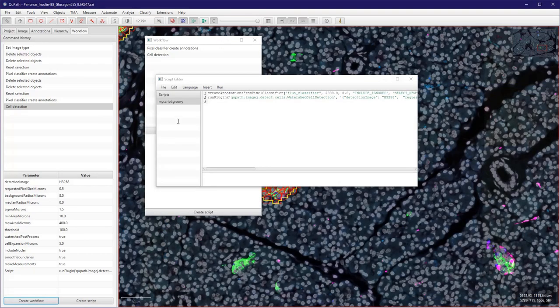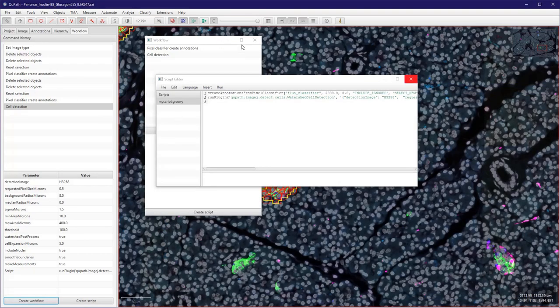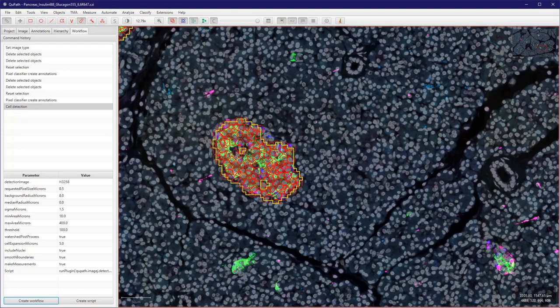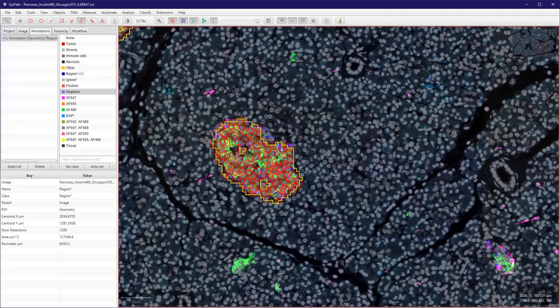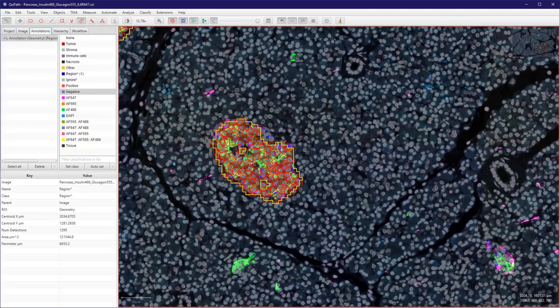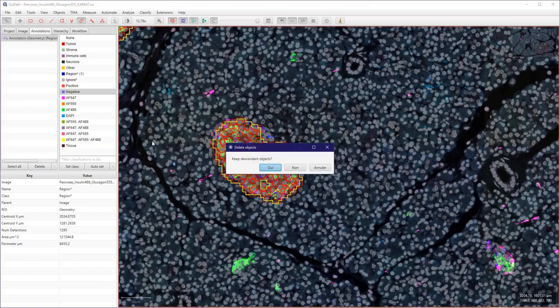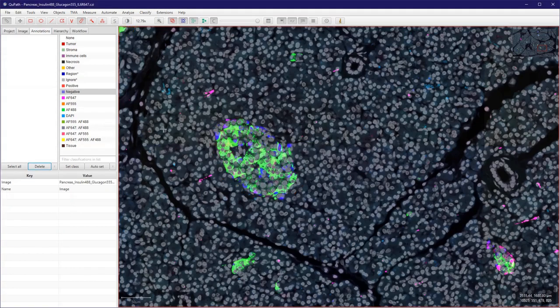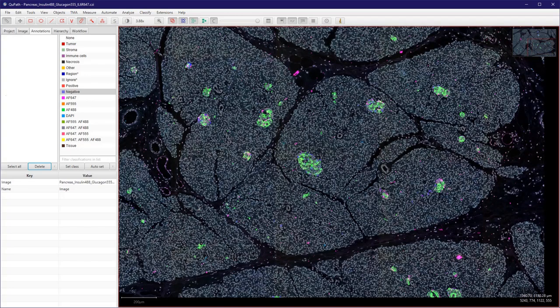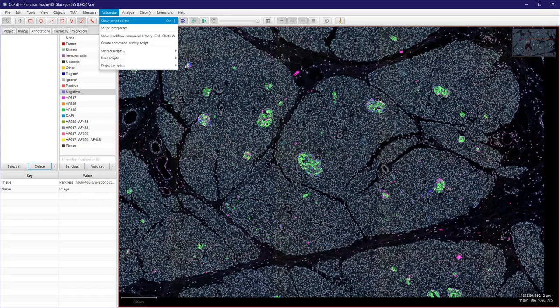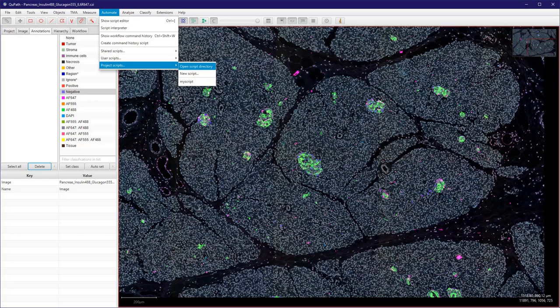OK, and let's go back here and remove this region. OK, I don't want to keep anything. And let's just call the script to see if it works. So you can go either to Automate, Show Script Editor, or normally if you save the script in the default location it should appear here.